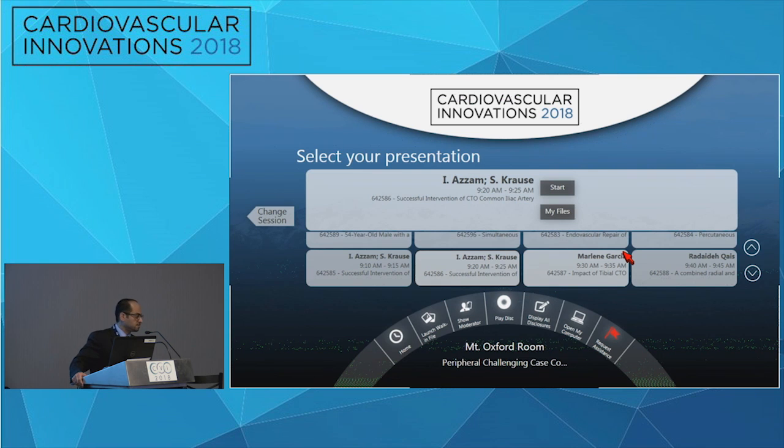One thing that I think might be a good option nowadays is the Terumo R2P system with a 6/7 Slender, 119 centimeter, that would give you the length to reach the iliac. True. Length is still an issue, but these cases were done in 2017. There weren't these long sheaths at that time.